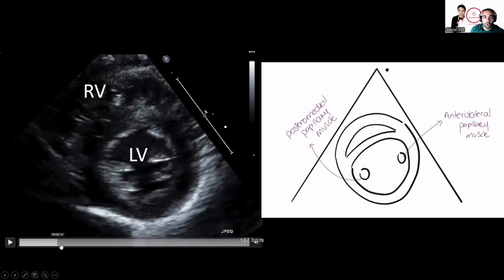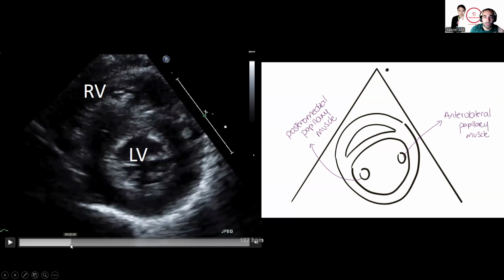Septal flattening, for information on what's happening in the corresponding outflow tract or great vessels, really has to be assessed at the peak of systole, because at the peak of systole is when you have your pulmonary valve and your aortic valve open. And when they're open, they're equalizing pressure with the underlying ventricle. So at the peak of systole, you can assume that the relationship between the RV systolic and LV systolic pressure will be the same as the relationship between the pulmonary artery and the aortic pressure. And so here we can see that we have a nice round left ventricle and a more crescenting, small, thin right ventricle, which informs us that the LV systolic pressure is higher than the RV systolic pressure.